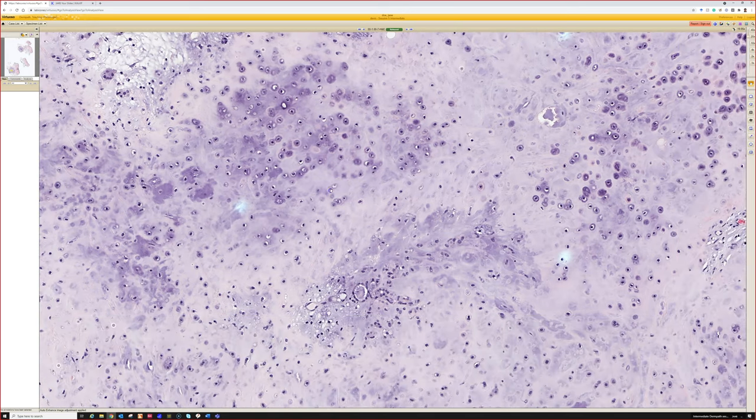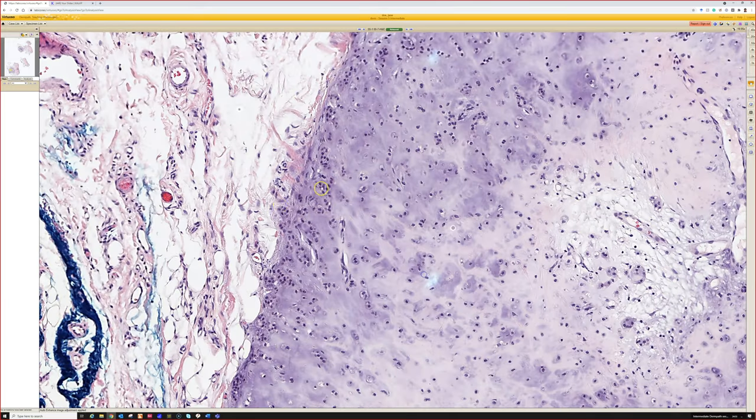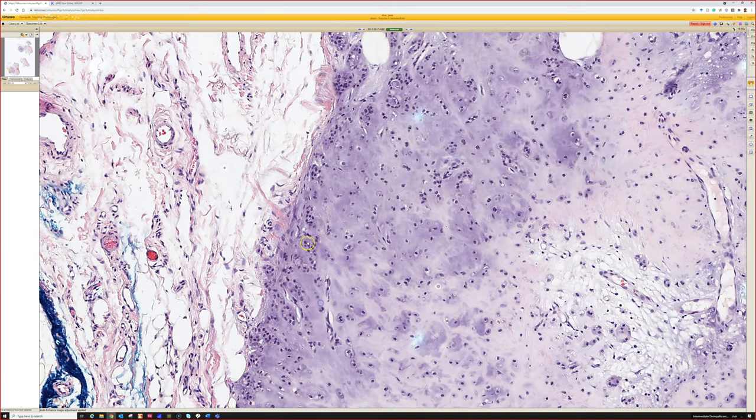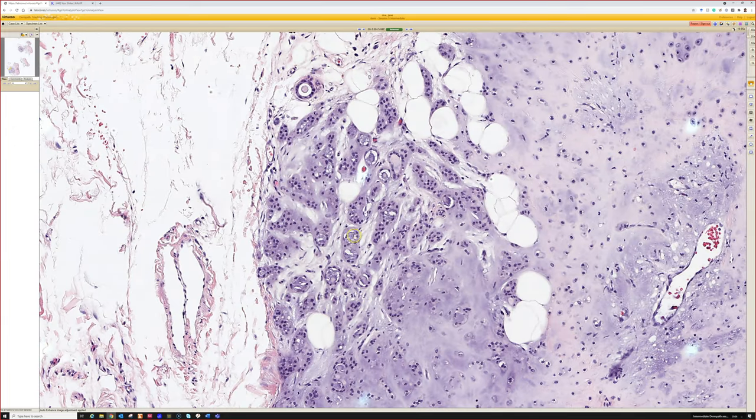But the reason we know it's not a chondroma, that it's actually a mixed tumor, is because it also has little tiny ducts and glands and tubules. So again, I told you mixed tumor can have a wide range of features. It really does. This one is kind of the small tubule form. You have just these little tiny tubules with little lumens, and they're tiny sweat ducts. And if you did a keratin stain, it would light these up, okay?